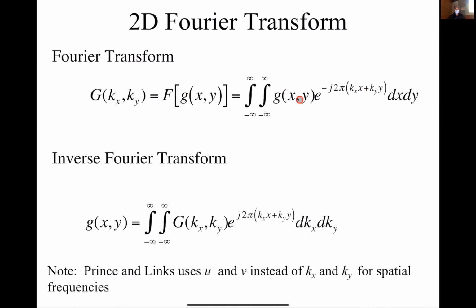So this multiplication step, you can consider that's the encoding step. That's what the gradients do. They impose this phasor pattern on my object. And then the receive coils do the integration. All right? So this is encoding, and that's integration.